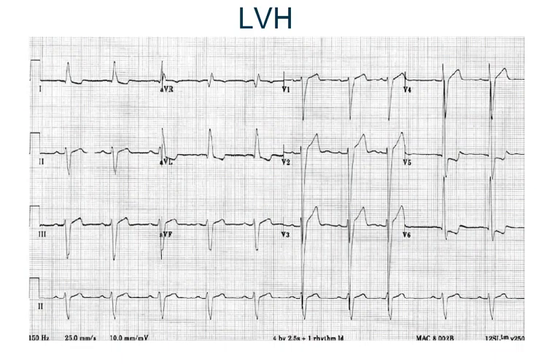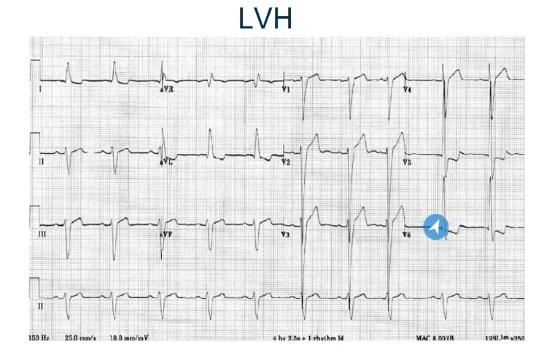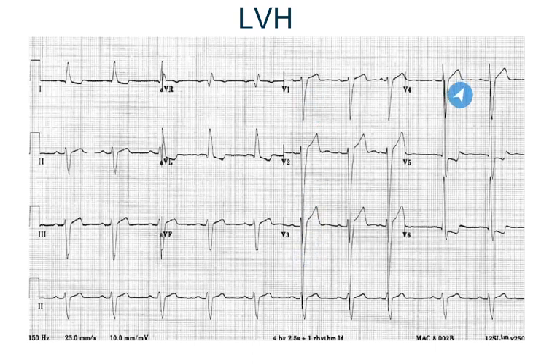Now if you compare this ECG of LVH with the previous one, look at the R wave — it's small in V1, then it starts becoming taller. When it comes to V5 and V6, it becomes so tall that it actually somewhat fuses with the S wave of the upper lead. If you look at the S waves from V1 to V6, they decrease in size but are deeper compared to a normal ECG.